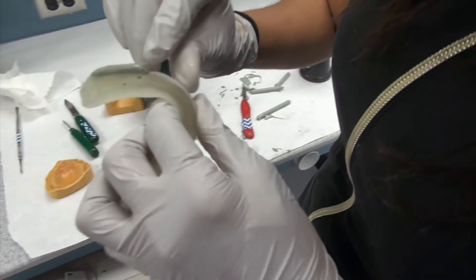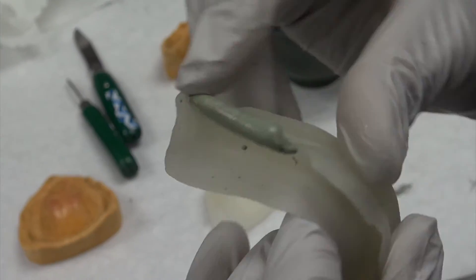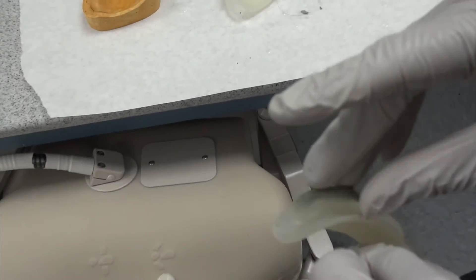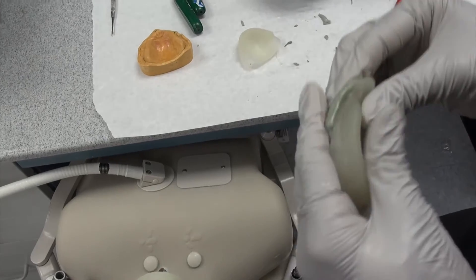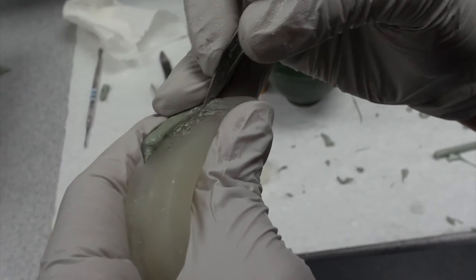So, see how after several tries, it's starting to become a lot smoother of a finish? And you can see that most of that clumpy mass has come off.